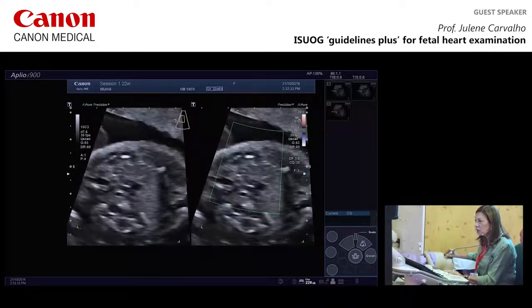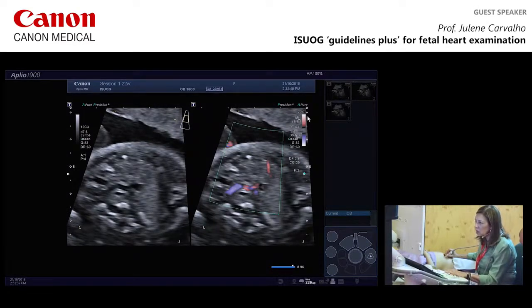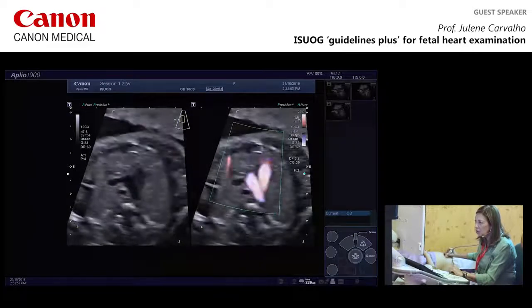You can see the normal subclavian artery. So the velocity here, it's not really velocity on the ADF, but it's kind of equivalent because you're decreasing your equivalent to a PRF here, but it's less angle dependent. It's quite nice for a small vessel, so that's coming from the aorta, so we are above the level of the three-vessel trachea view, and very nicely there, your thymic box as well.